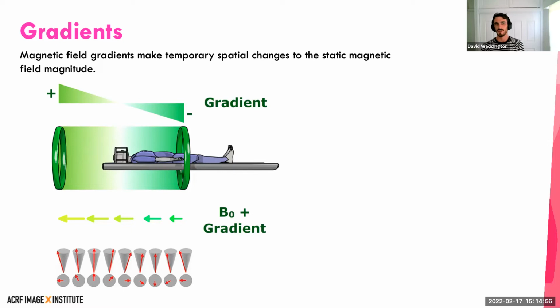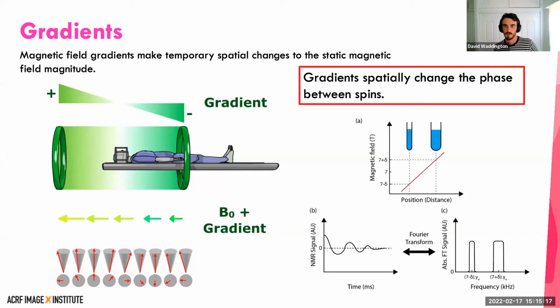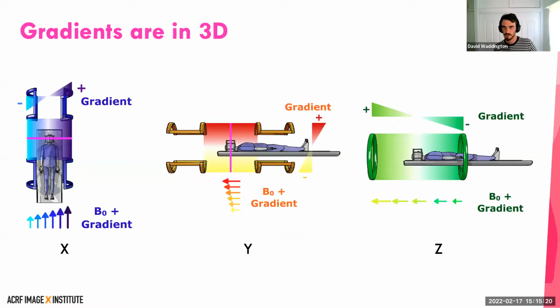And so essentially what's happening here is that when we take an MRI scan, really what we're doing is we're magnetizing spins, and then we're making them rotate, precess, at very slightly different frequencies all over the body, using these gradient fields, and then turning that into an image. That's just an explanation of what I was doing with my fingers. These things are in 3D. The point is more to say that these gradient fields are everywhere in the MRI scanner, and we can really tune each point of the body to have our spins, our nuclei, precessing, rotating at a different frequency.